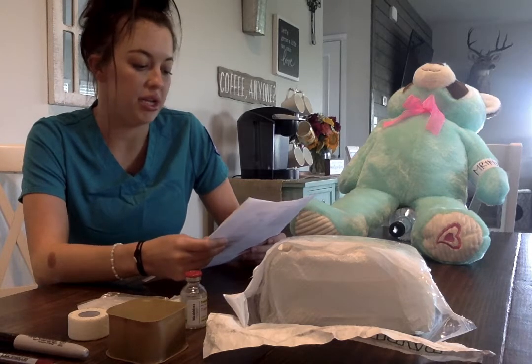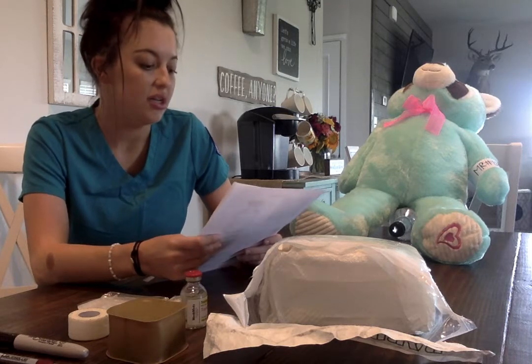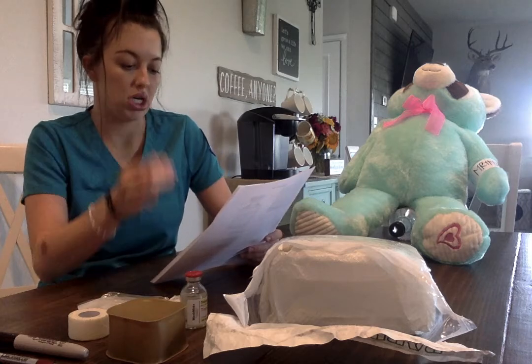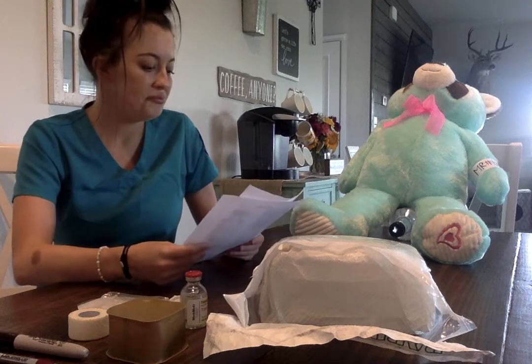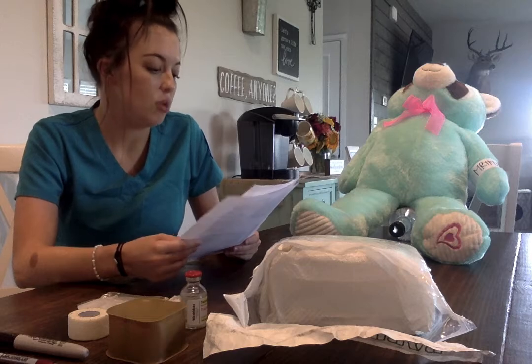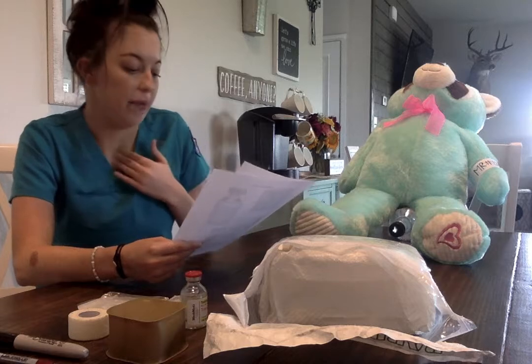So I have Marcus Perez, a 58-year-old male admitted yesterday for a left knee arthroplasty related to osteoarthritis. He reports his pain is now 4 out of 10. He has been experiencing urinary retention since surgery and has new orders to start a foley catheter. It is now 9 a.m. The healthcare provider's orders are to insert a foley catheter, give heparin 5,000 units sub-Q every 24 hours, and morphine 2 milligrams intramuscular every 4 hours as needed for pain.